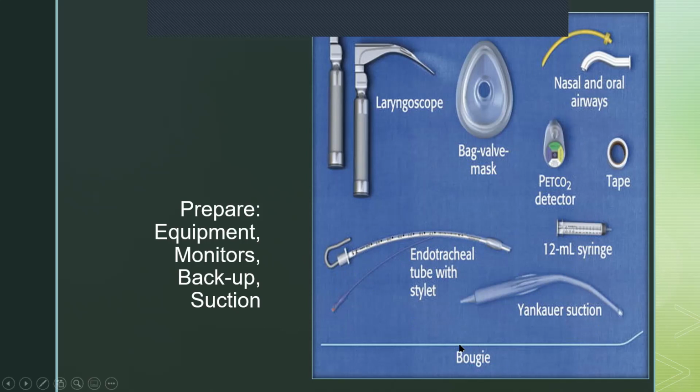And then a bougie, or boogie, whatever you want to call it. A bougie is there to help you basically get into the area. The advantage of a bougie over a tube is quite simply the size. It's extremely thin. So if you can just see bits of the airway, the bougie allows you to go in there, and then the tube runs over the bougie. You can see it's got a little tip at the end, which we'll talk about just now. So that's mostly your equipment.